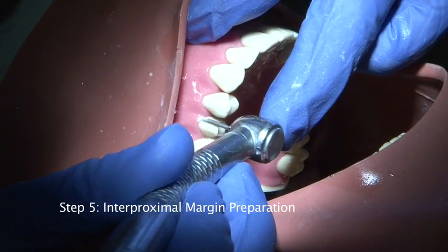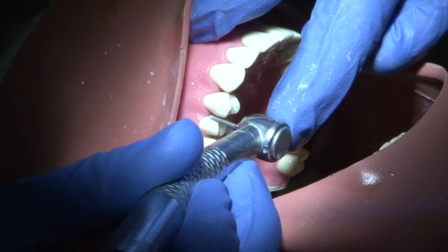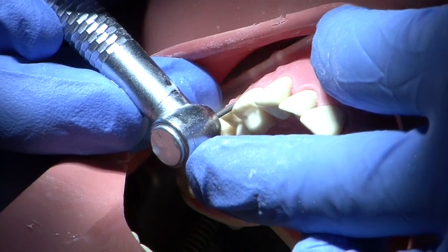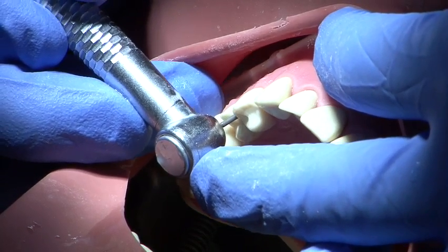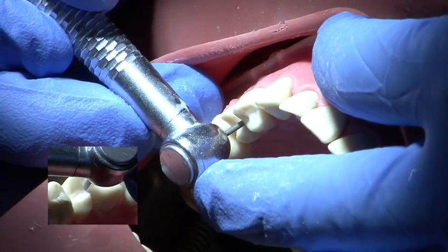The interproximal margin is then prepared using a parallel sided medium grit round ended burr. The degree of reduction will depend on the amount of ceramic show required and will vary between 0.7 and 1.5mm.